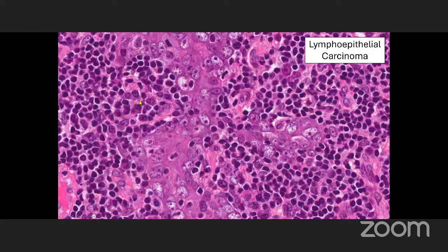And so lymphoplasmacytic infiltrate, and here you can see these sort of poorly defined collections of tumor cells, ill-defined cell borders, vesicular chromatin with prominent nucleoli, and this kind of, I call it a drunk pattern, where some of the nuclei are touching and some are far apart from each other. They look very disorganized. So that's a very classic lymphoepithelial carcinoma pattern, and that really should prompt you for EBV testing if you see that in the sinonasal tract.